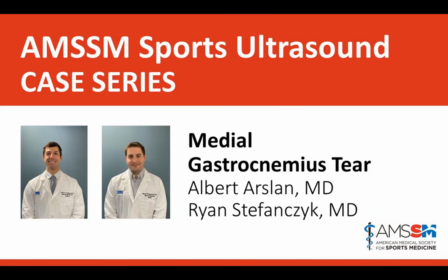And so we think the ideal timing of these muscle scans is around 36 to 72 hours post injury. Now, also, like you guys mentioned, and Brennan as well, if you're for whatever reason forced to see these a bit sooner, I have a really low threshold, we'll scan them, but I'll bring them back in a couple days just to make sure I'm not missing something. Because again, you can get burned if you scan these too early. And then lastly, the point about doing follow-up scans, I think, is really important.